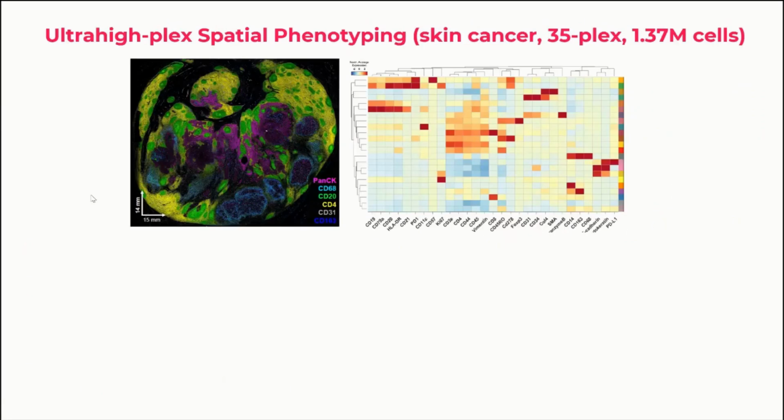And so this is now when you look at that same tumor. On the left, we have this tumor on the periphery here, the active tumor cells. So the tumor on the periphery is almost dying or necrotic. The tumor regions in the middle, in the purple, are still alive and growing quite aggressively.